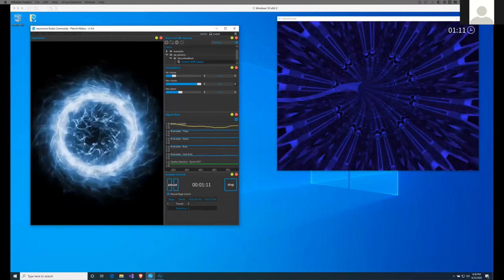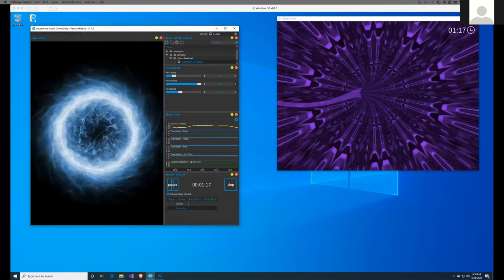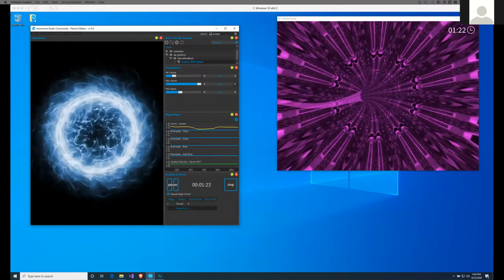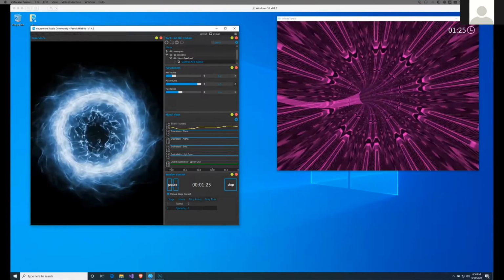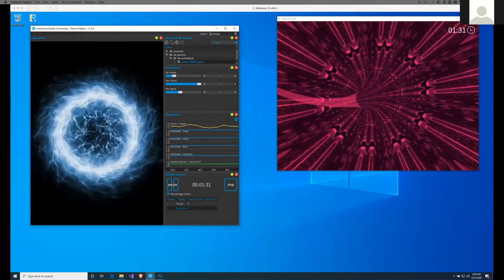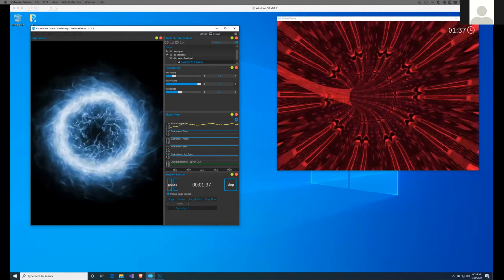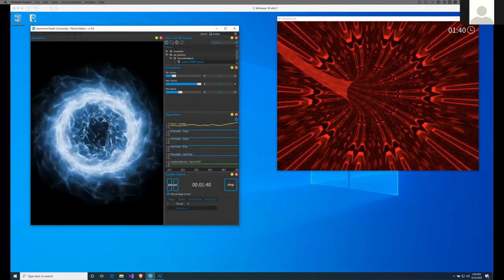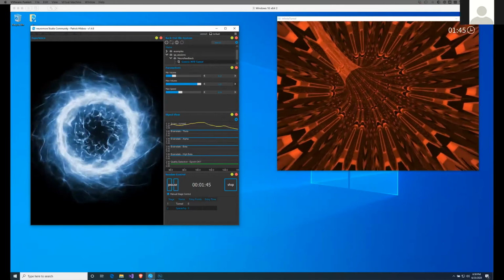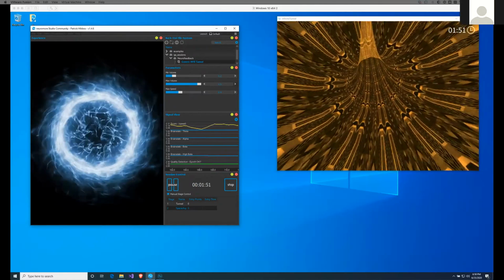I'll wait for that. Continue as you are now. You are becoming more and more focused. Yeah, and we have those audio cues, right? So you can play them more frequently or less frequently. It sounds better if there's some background music, but this is just to showcase it more clearly.